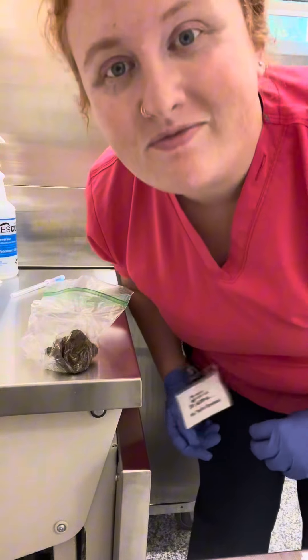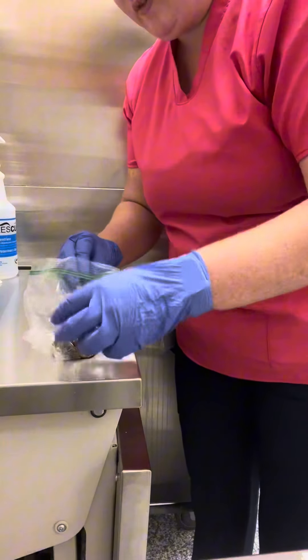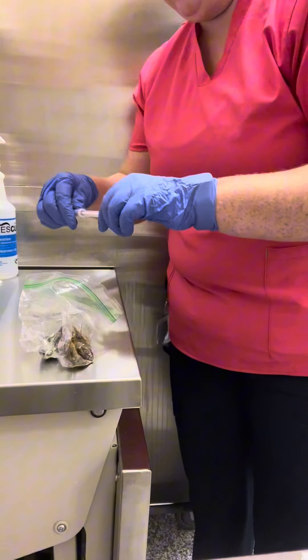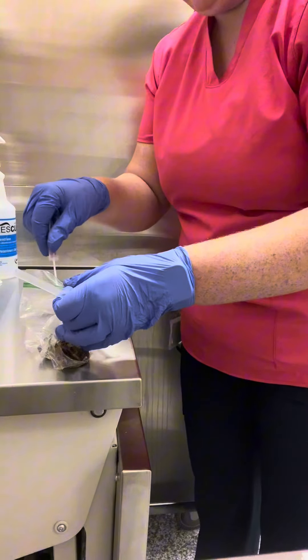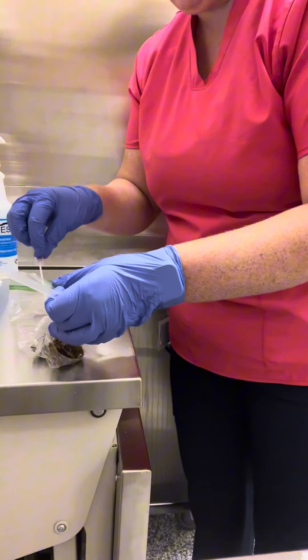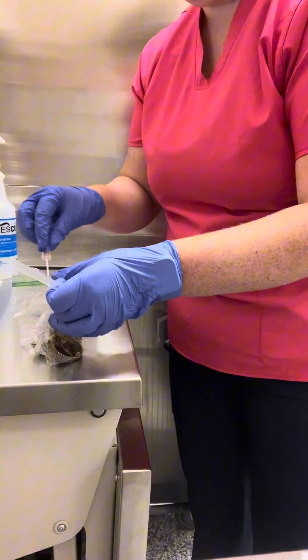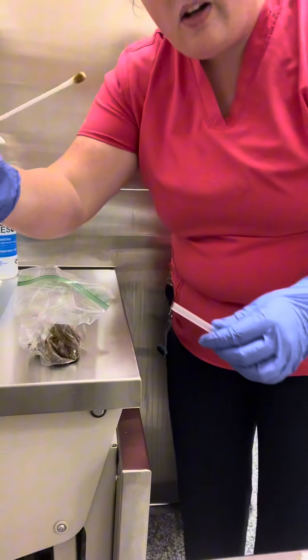Brianna, hello. So I've got a fecal sample here. I'm going to remove my swab and dump it in the fecal matter. I don't need a giant sample — not too much fecal material, but a decent amount on there.